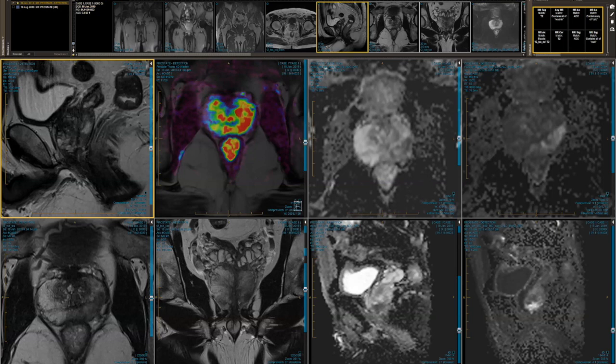Now, we better get onto the biopsy, because I'm mindful that time's getting away from us. Before we do that, though, a quick question for you, Veeru, that's come in through the chat relating to this particular case. If your DRE is abnormal, but the MRI is negative, and you've got a low PSA density, would you still biopsy?